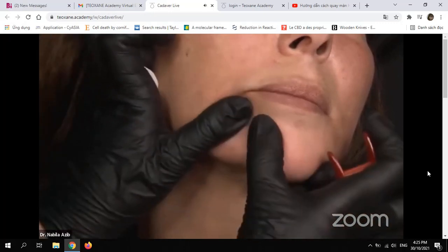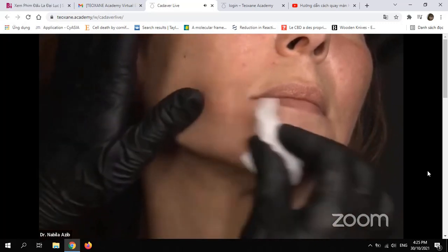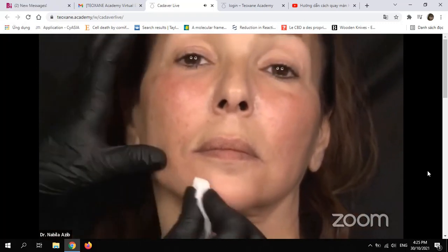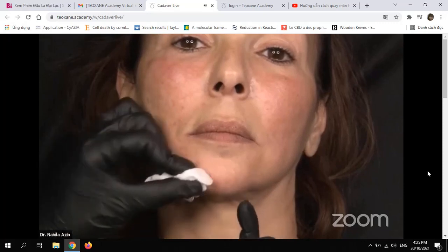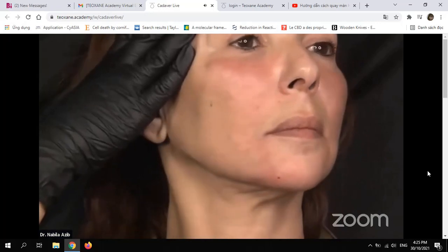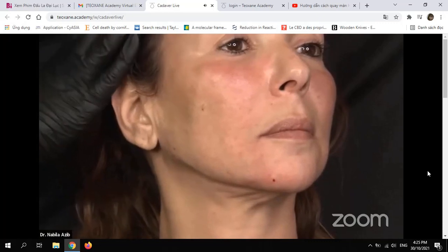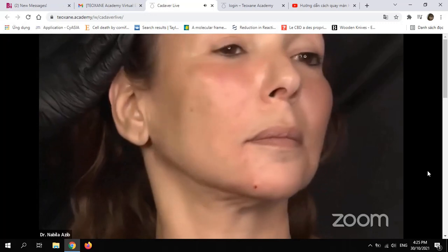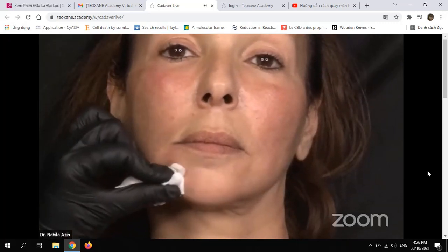You just completely erased the shadow from this area now. Thank you. So let me check with the frontal view. You see, no more print here on the bone. Yes, and here a nice light coming into the pre-jowl area. Exactly, and no more jowl. And the commissure is lifted too, in comparison to the other side.